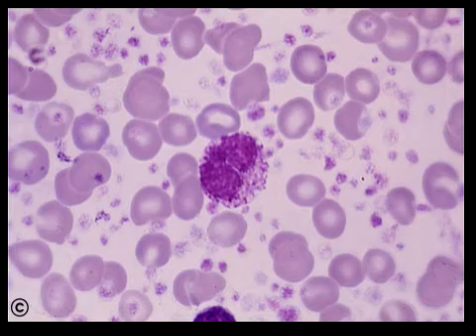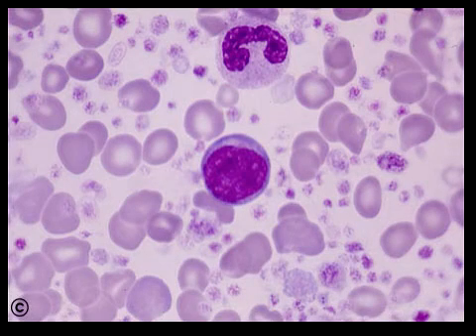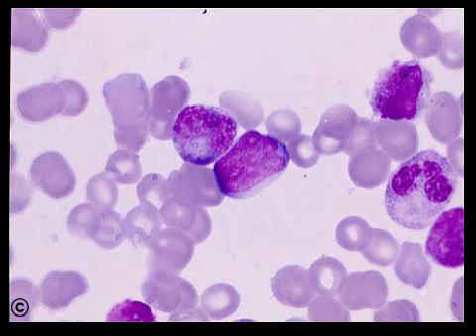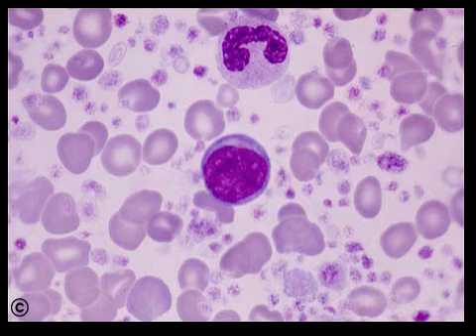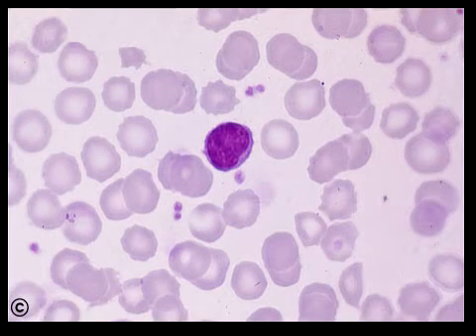So what we have next is a lymphoblast. And if you ever come across cells that look like these, they are known as lymphoblasts. And then this is a prolymphocyte. So this is a lymphoblast, and then the next step would be a prolymphocyte, which is right here. And then we have a lymphocyte, and this is what we usually will see when we look at slides. We'll usually see it in this form.